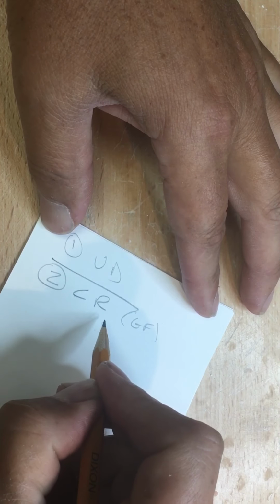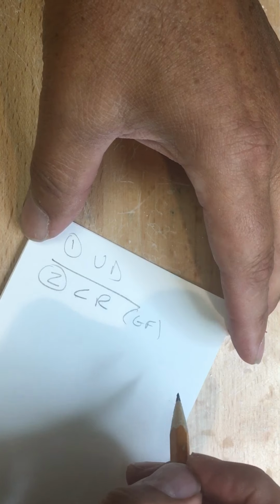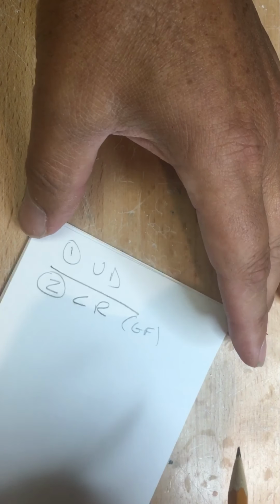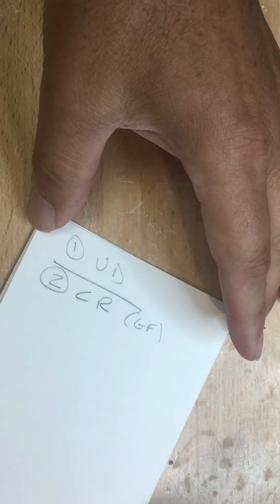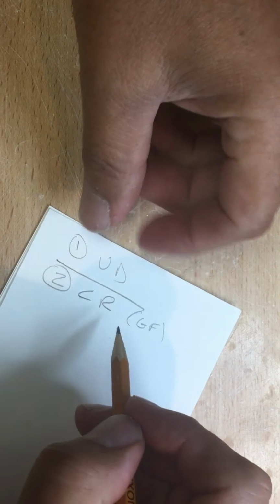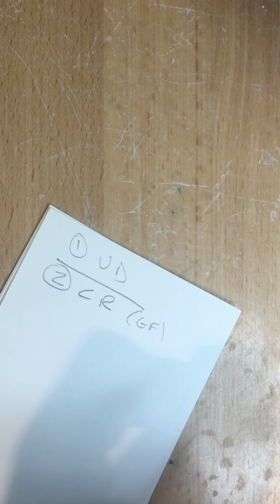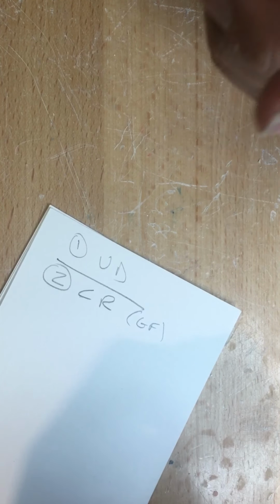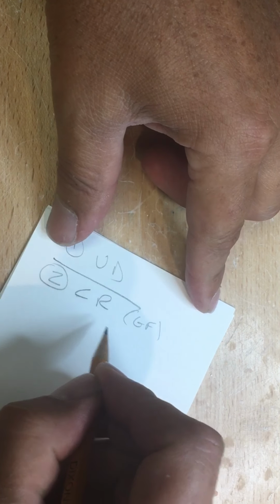It will occur if the opposing is a full maxillary denture or a long span class 4 where there's no canine guided occlusion. Basically, we're reestablishing in centric relation the position of the head of the condyle in the glenoid fossa in the most retruded position, unrestrained. This is the centric relation record.